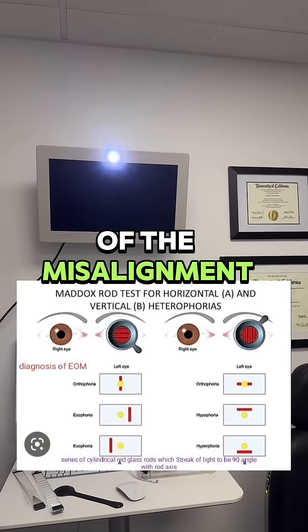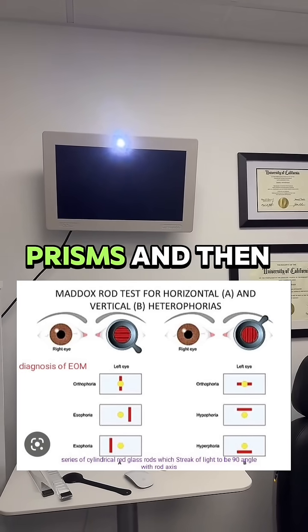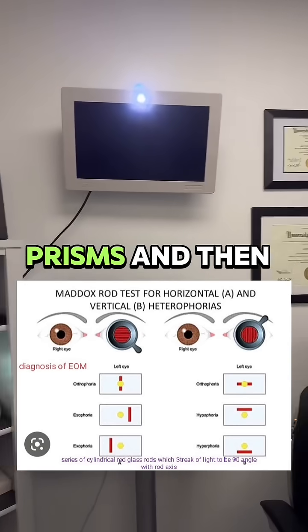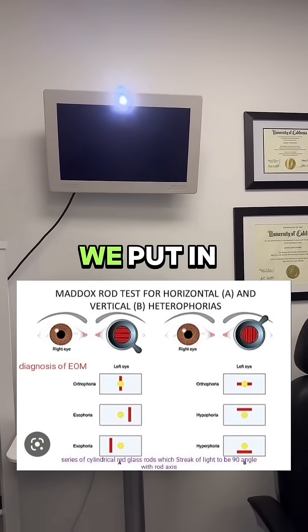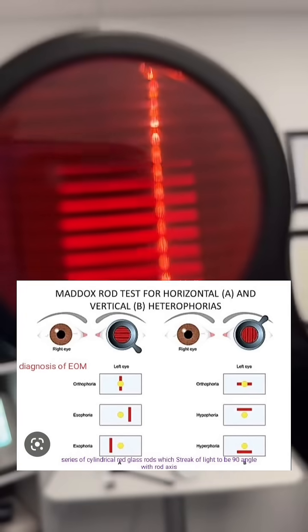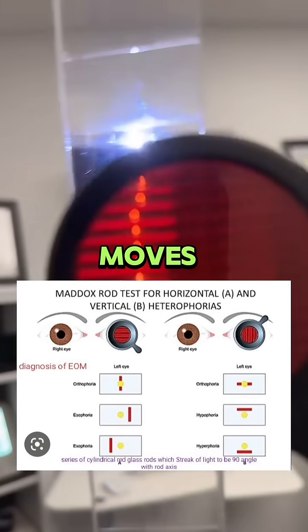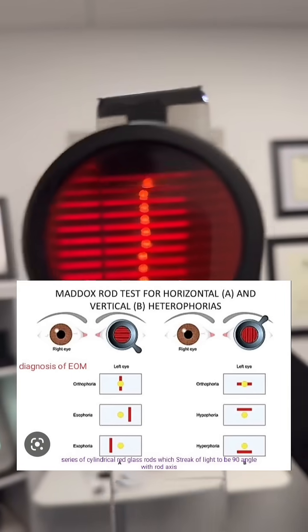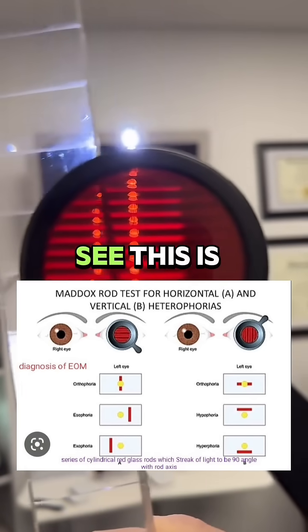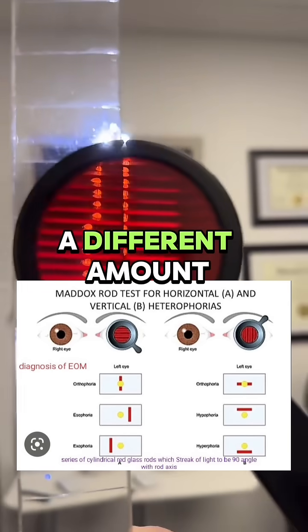And that's exactly what we measure with the prisms. We use the prisms and put enough prism to move that image. See how the light moves — this is exactly how we measure it. This is how far off they are; each prism moves the line a different amount.